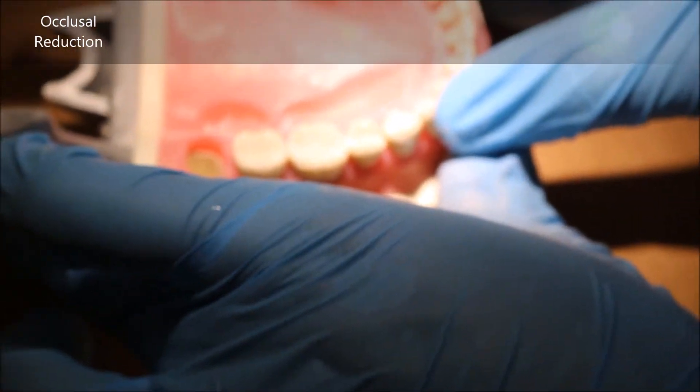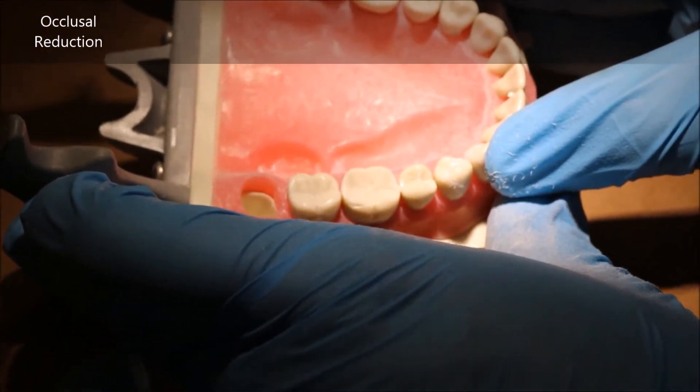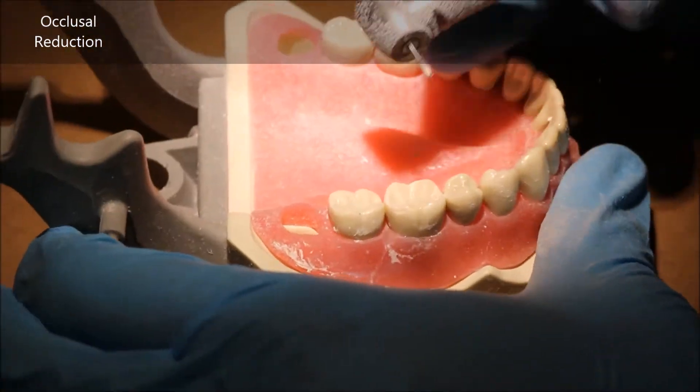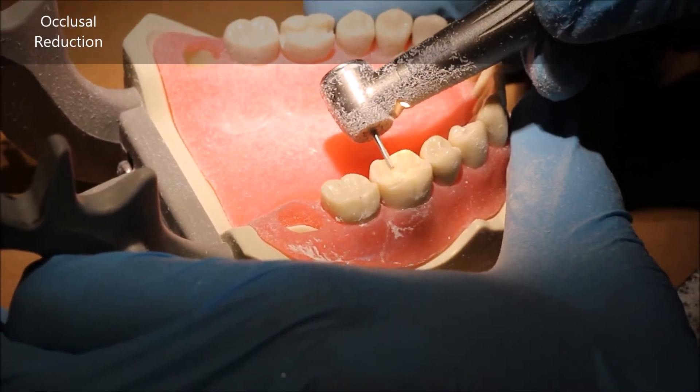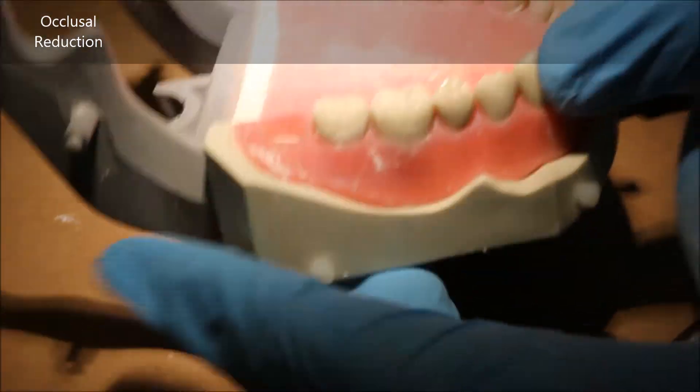It's better periodontally for the patient, it's easier to place and verify, and it's easier to capture in an impression. Therefore, you want to do the minimum amount of occlusal reduction that is necessary to have a good gold restoration.